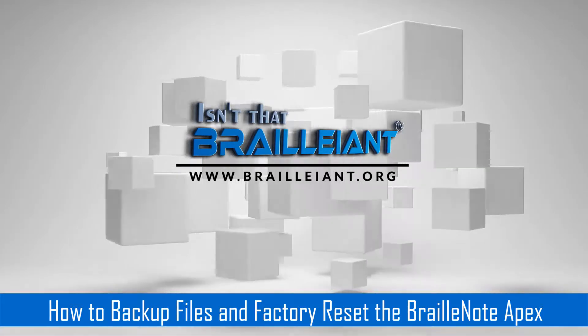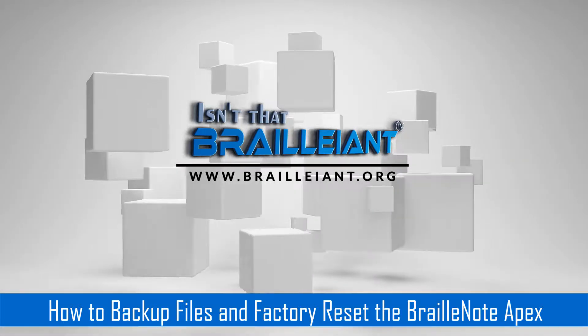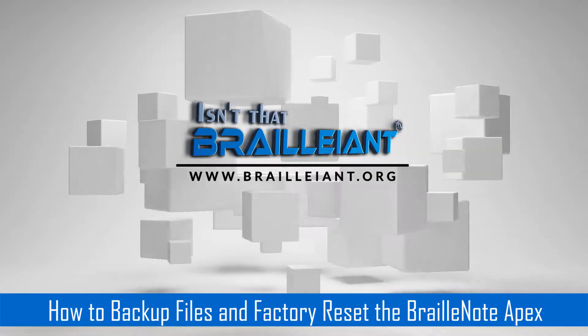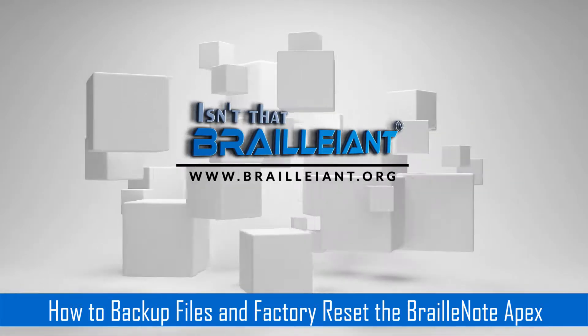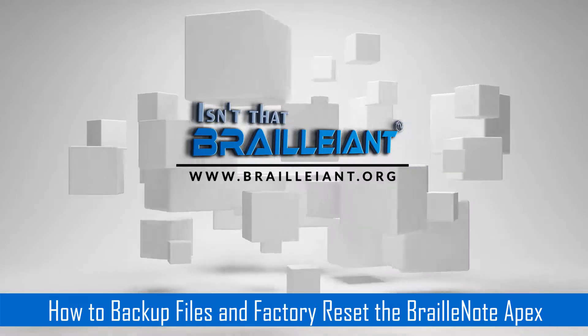Now I'm going to press U — Utilities menu — and B. 'Do you wish to backup or restore files?' B for Backup with drive. 'Presenter for Flash Disk.' We want to backup the Flash Disk. The Flash Disk is your internal hard drive. The Hard Disk is your flash drive.